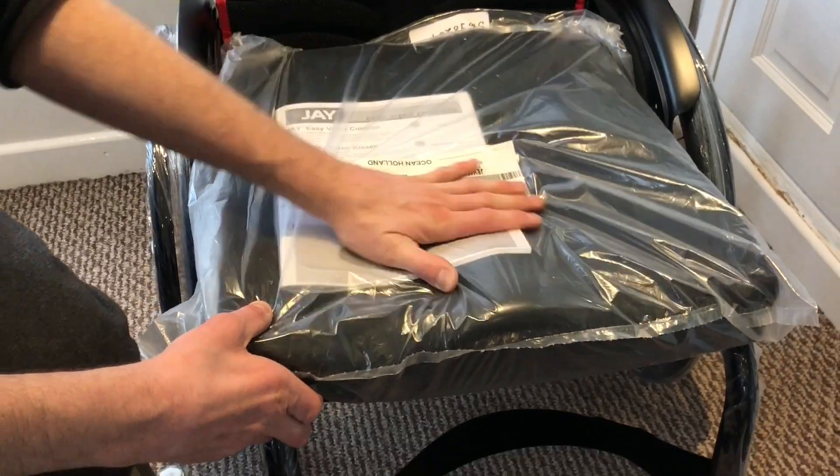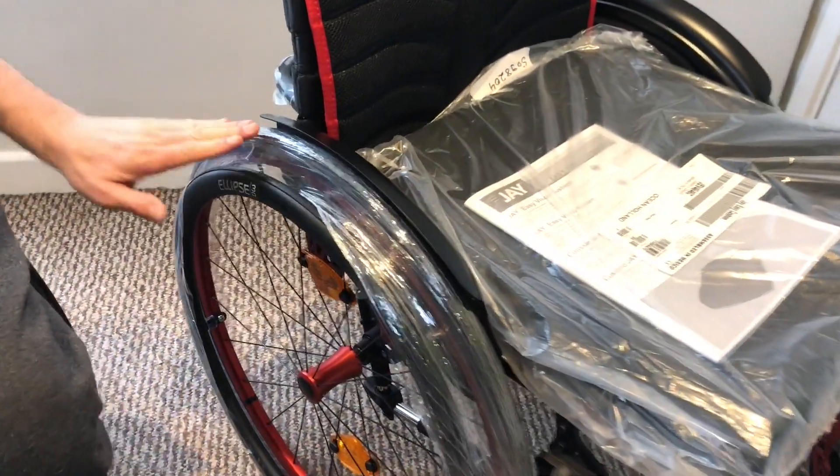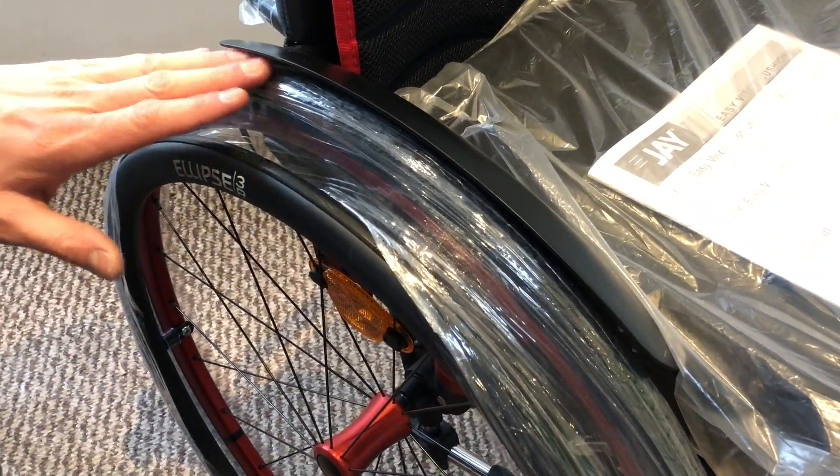It's also got the contour, and the customer's gone for the fender side guards, which almost adds like a mud guard to the side of the wheels.